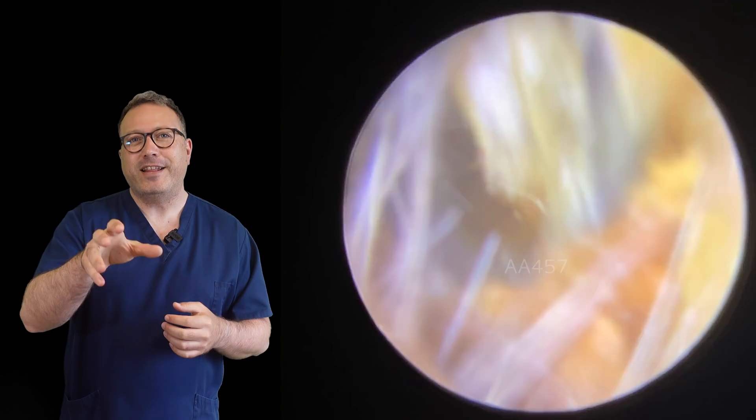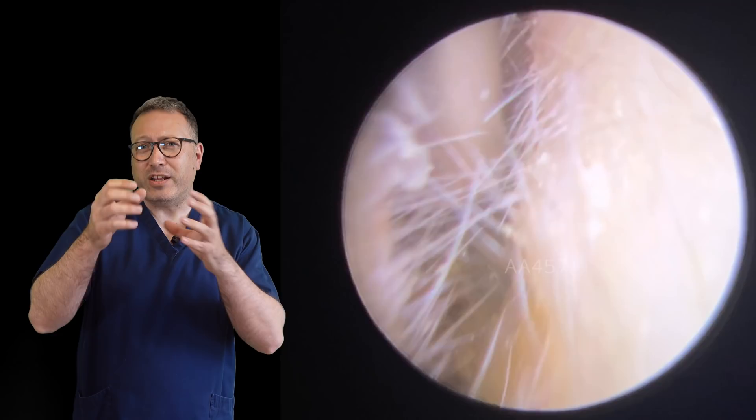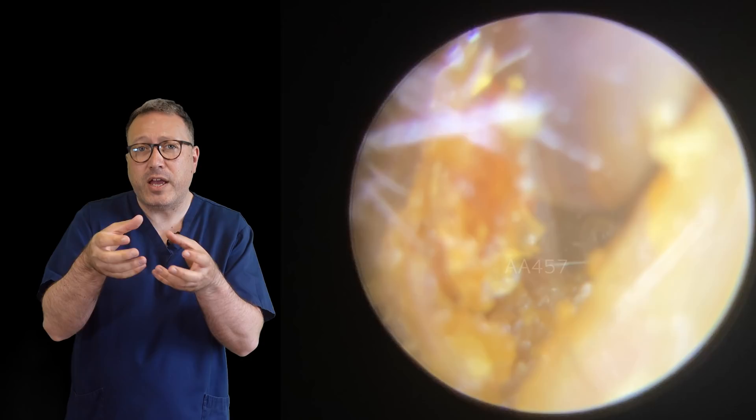We've got the Jobson horn in here now, just loosening this next little bit of wax. You can see that piece coming away, and then we're just tidying up. We always go back in with the suction tube after using the Jobson horn, because sometimes you'll leave little bits of debris that have stuck to the canal walls or collected around the bottom. So I always go back in with the suction to tidy those up and give me a clearer view. And you can see we've pulled a little bit of skin across and repositioned it so we can get the jaws of the forceps around either side.